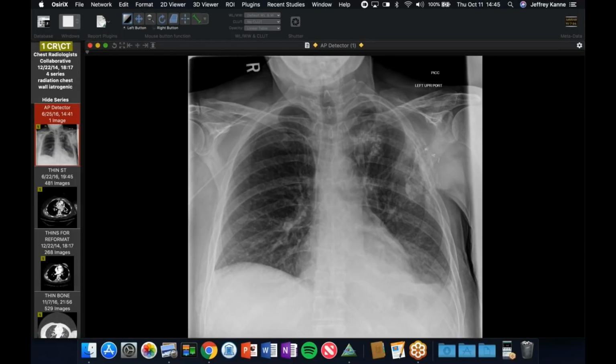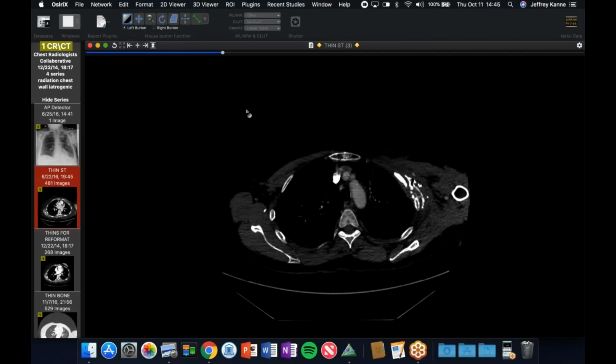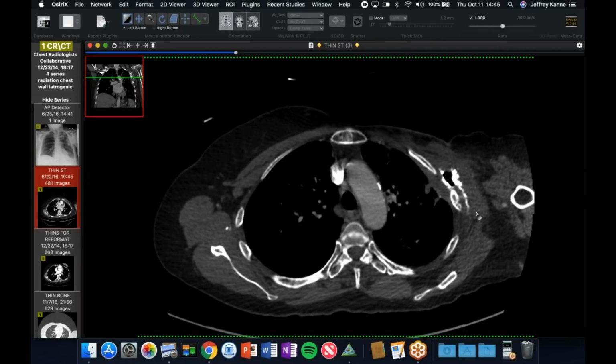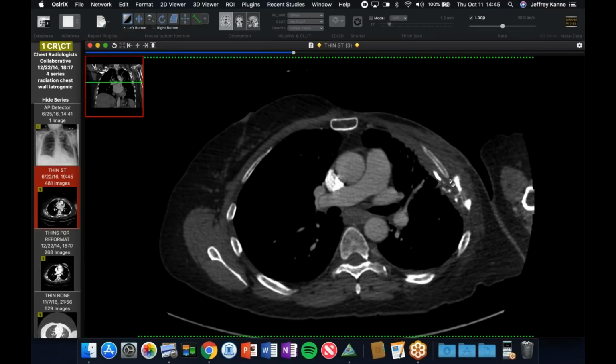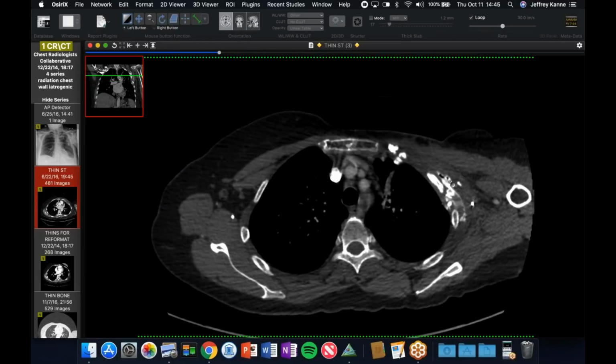And so this is a CT from just a few days before that. And at the time, she was having a lot of pain. And you can see there's all of this bone formation. There's even gas in there, a lot of soft tissue swelling around there, but this just extensive ossification with this dense bone bridging multiple ribs.